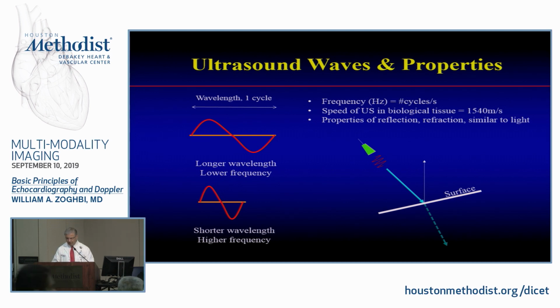Interestingly enough, for those of you who reflect on things as opposed to just taking them for granted, because you're sending the ultrasound from the same transducer, what you're going to process coming back is the tiny fraction that goes back towards the transducer. So most of what you send is actually lost.